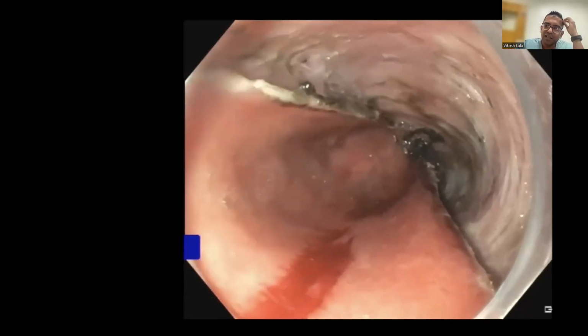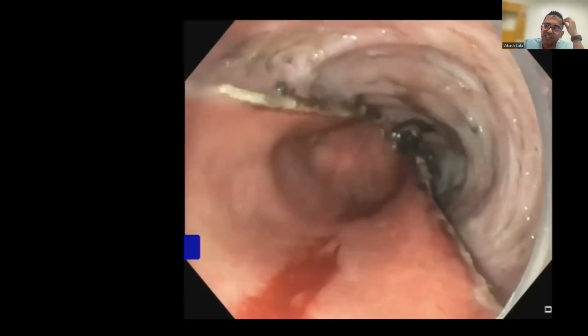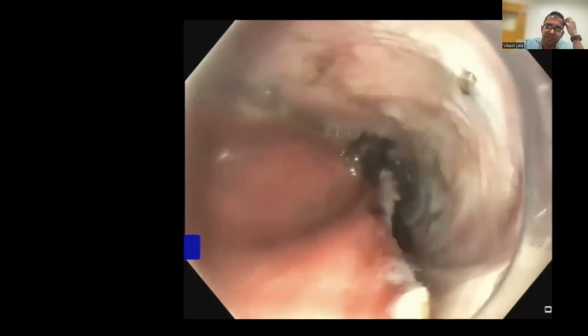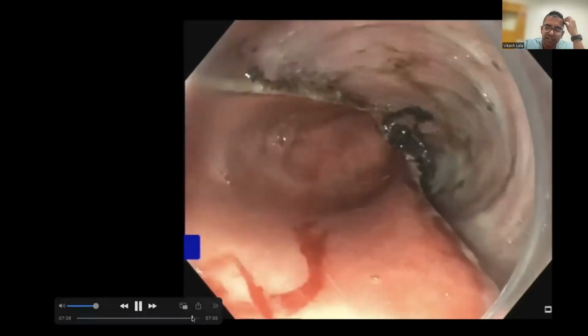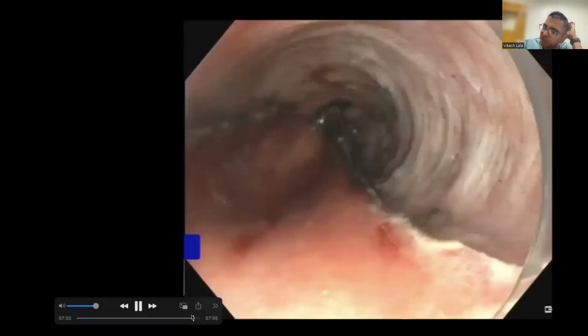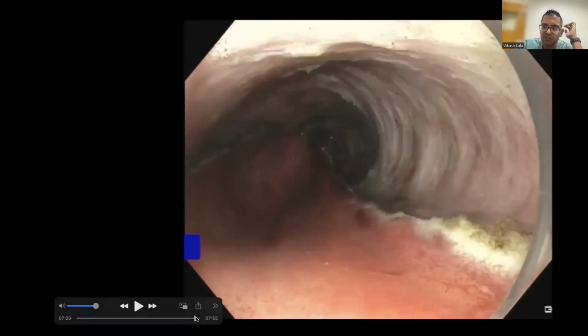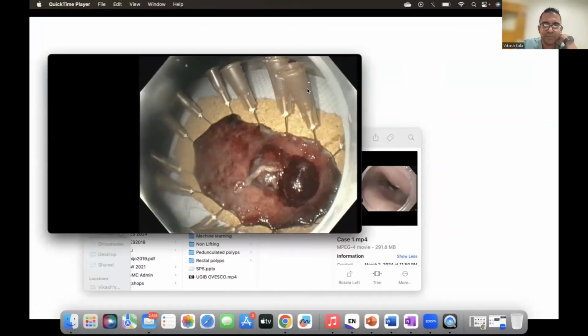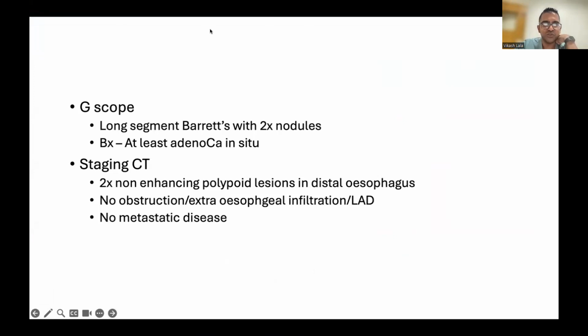Again, technique and method choice of resection, I think, is beyond the scope of this talk. The talk is more about imaging. So we can chat about that at some other stage. But I decided to perform an ESD, and I'm just going to quickly show you the resection specimen, but I know Prof Hale is going to show you that in a bit more detail. So let me just jump forward. That's essentially what came out. You can see your malignant nodules there, and you can't see too well, but that's the area I was concerned about as being dysplastic. Thanks, Prof. I think I'll hand over to you now.